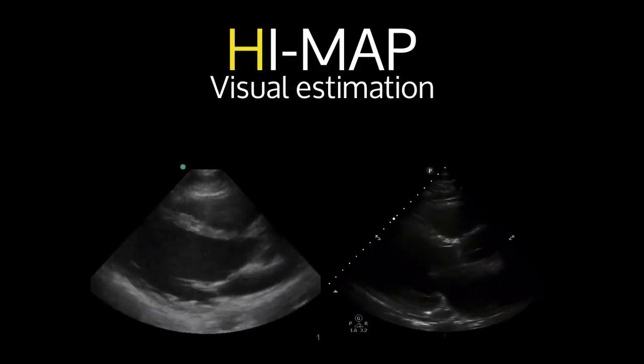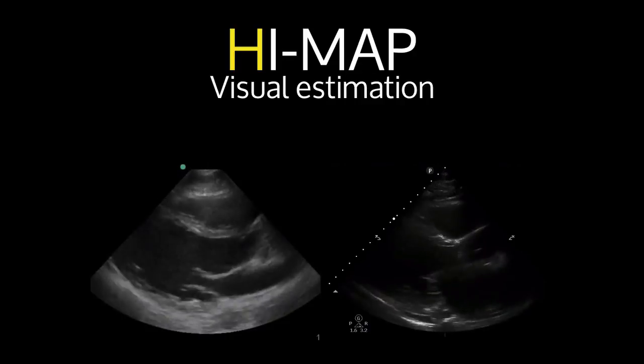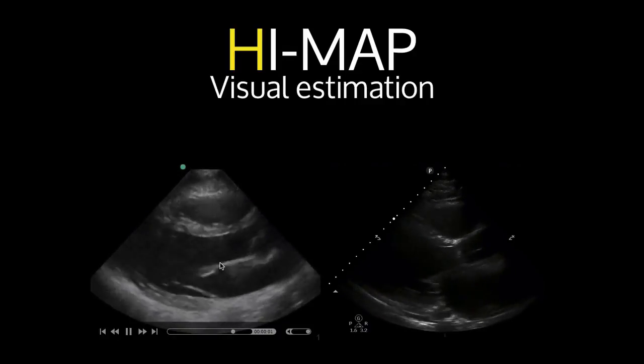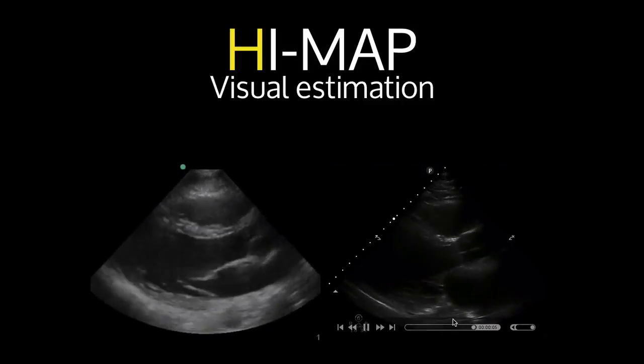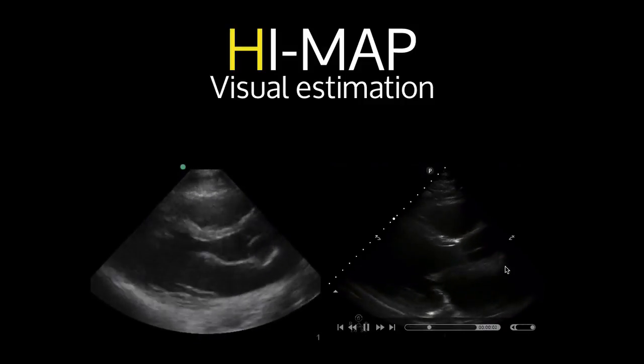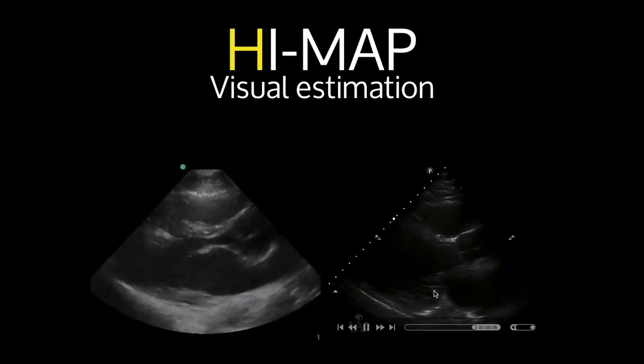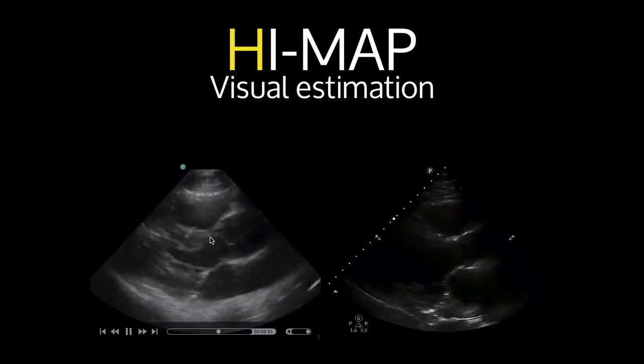On the left side of the screen, you see a parasternal long axis view of a heart that's beating well. You can see here the ventricular walls are coming together nicely. The mitral valve is coming up and nearly hitting the septum here. Now compare that to this image over here. You have the same parasternal long axis view. These ventricular walls are not moving very well, and this mitral valve is not moving very well either. This is a patient with a low ejection fraction. This is a patient with a high ejection fraction.